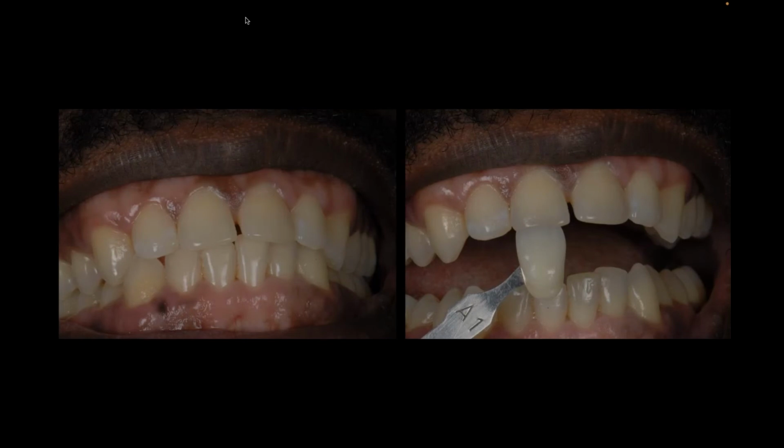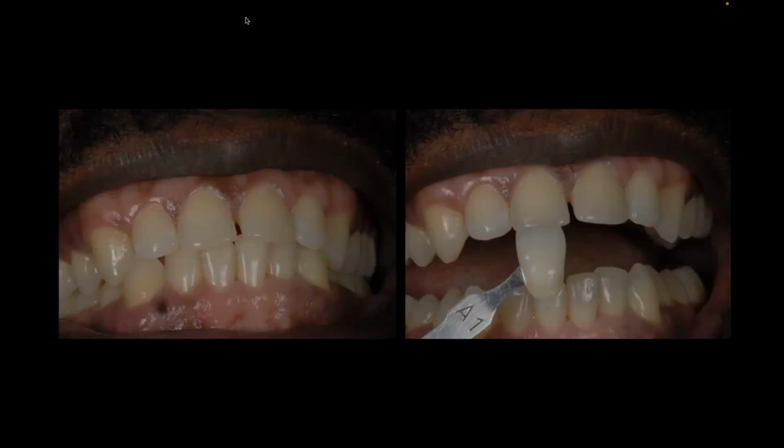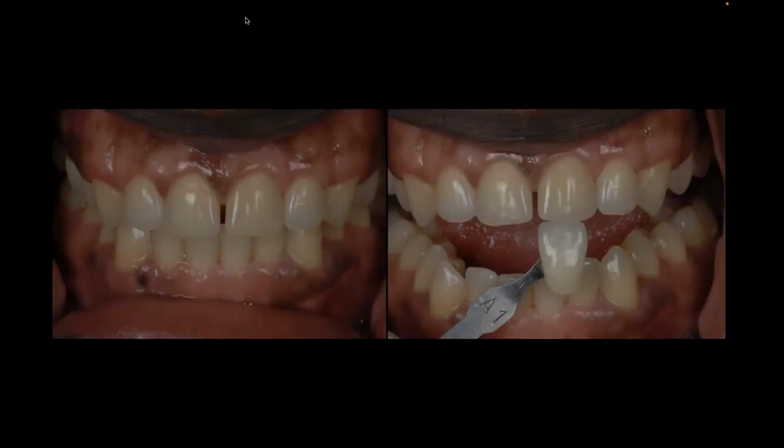And just as an example, I've showed before, this is a patient laying back in the chair, the way you just saw in that previous picture. And you'll notice the doctor's doing what they think is right, putting the shade tab up inside the ledge, taking their photos. Well, this is the same patient out of the chair, sitting up in my office with the exact same camera.